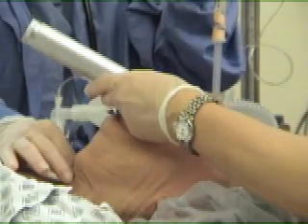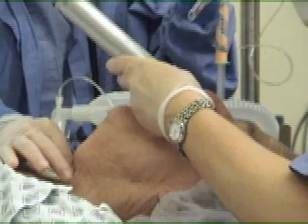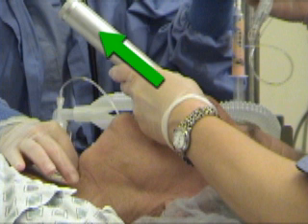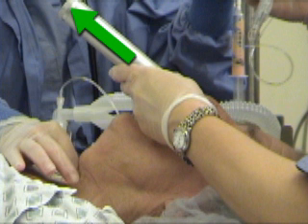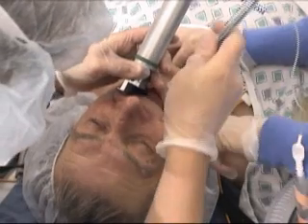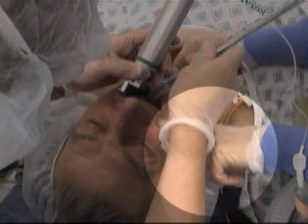When the tip of the blade is correctly positioned, lift the laryngoscope upwards and forwards at a 45-degree angle. Direct the force of your lift along the axis of the laryngoscope handle in the direction of the ceiling over the patient's feet. Avoid bending your wrist or rocking the blade against the patient's teeth, which can result in dental or soft tissue injury and will not enhance the view of the glottis. If available, an assistant should gently pull on the right side of the cheek to enhance visibility of the glottis.